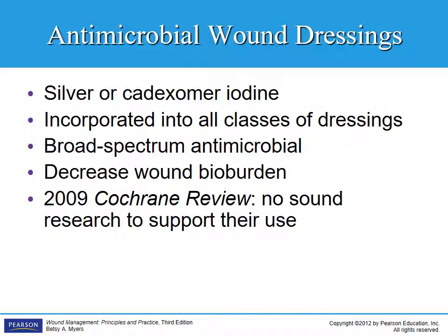So some examples of antimicrobial dressings that I've already talked about are silver or iodine dressings. It is a broad spectrum antimicrobial. It does decrease the wound bioburden. We talked about bioburden already, which is the amount of colonization of bacteria that's on the wound bed.